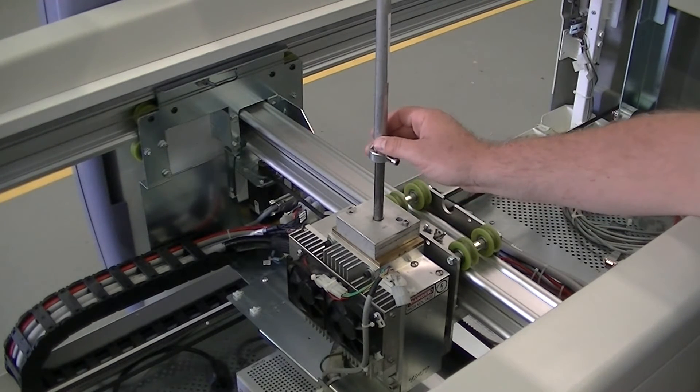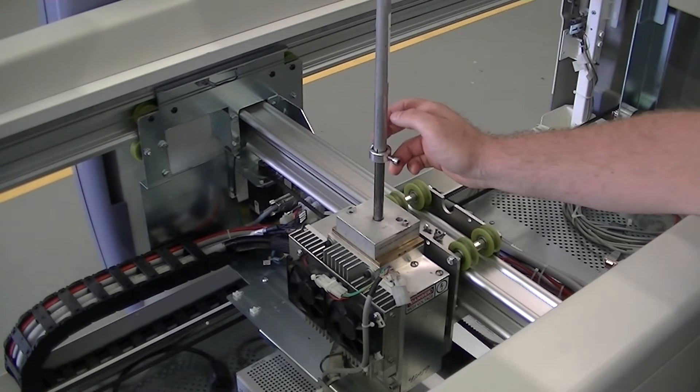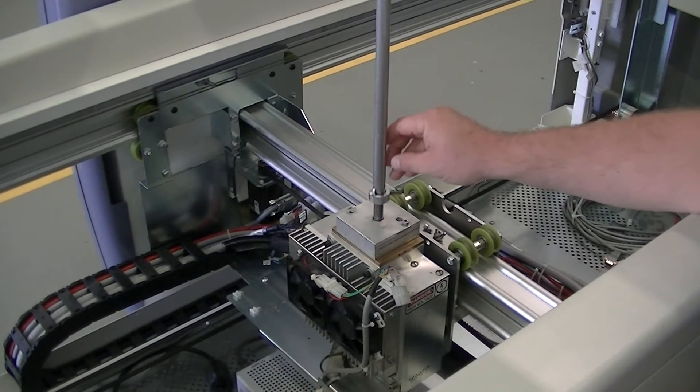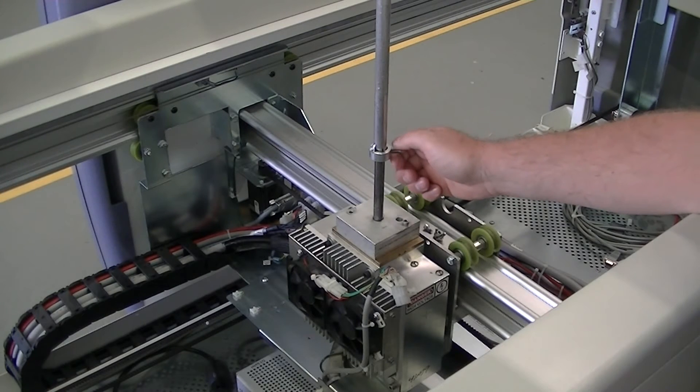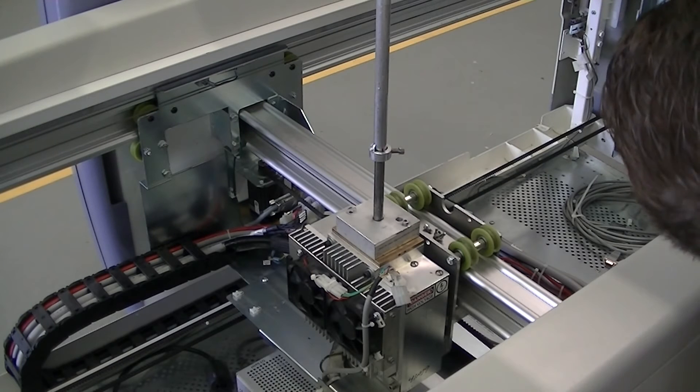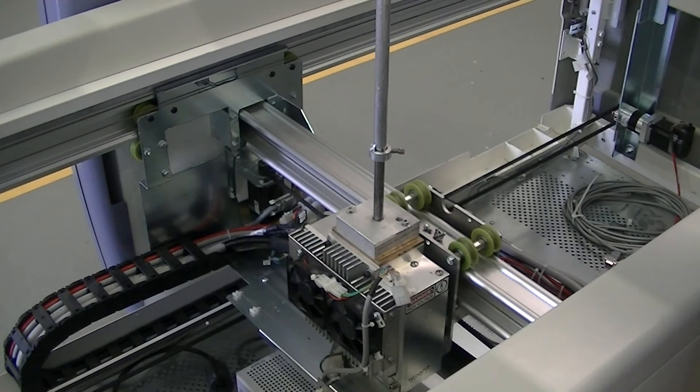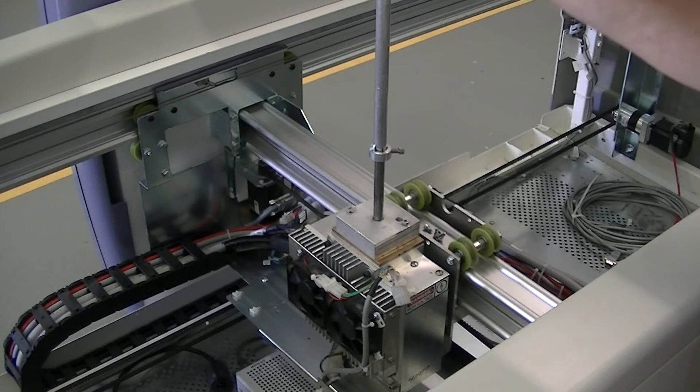From here, we want to adjust the alignment rod so it's just touching the top of the plastic. You do not want to poke through the plastic. From here, we want to verify that the alignment rod is centered on the slot of the detector, both this way and this way, which this one is.